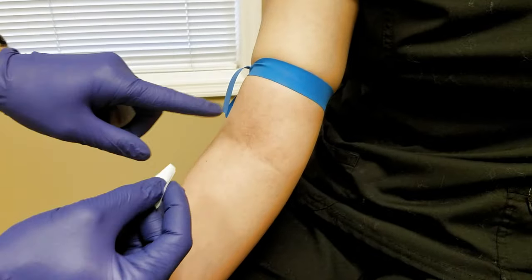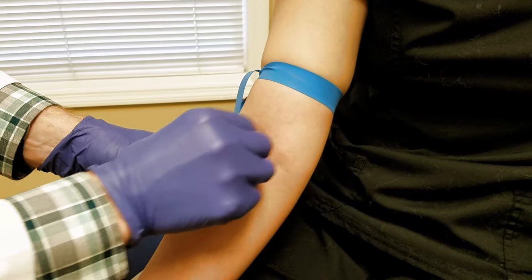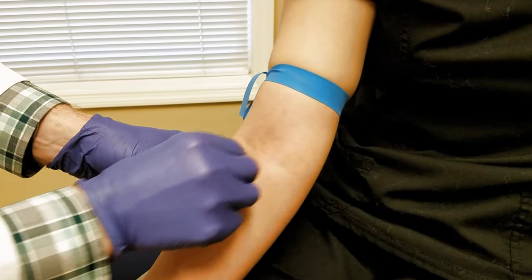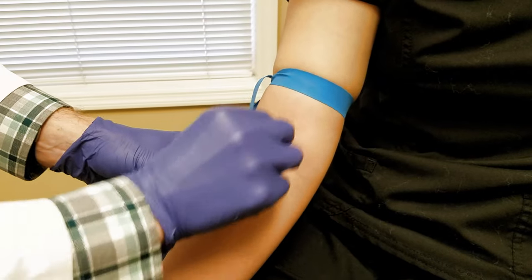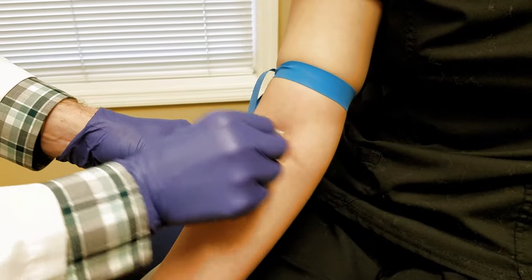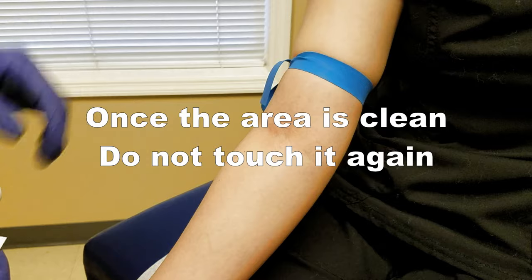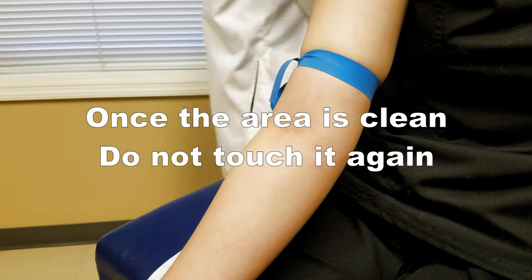All around where the needle's going to go, take your alcohol and rub it in different directions. Don't be afraid to rub, because the friction kills germs just as much as the alcohol. Go circle one way, circle the other way, up and down, left and right — that way we know it's nice and clean. It doesn't take long to dry; it will be dry by the time we get back.